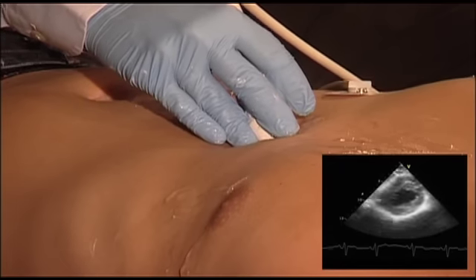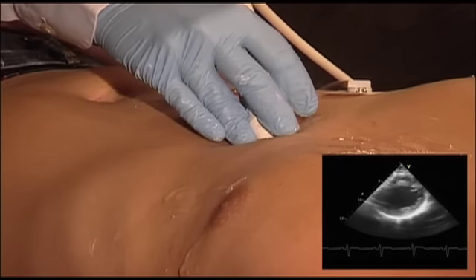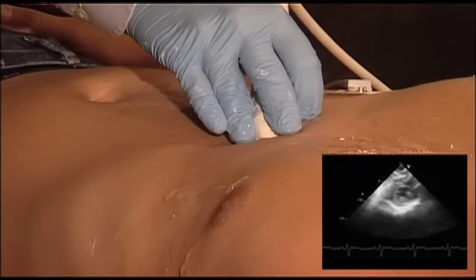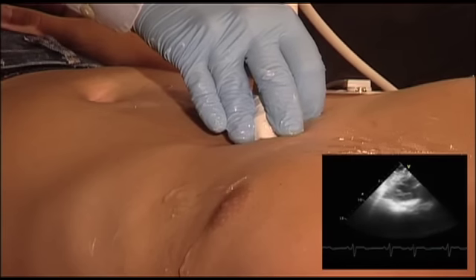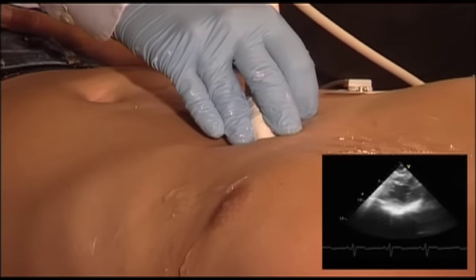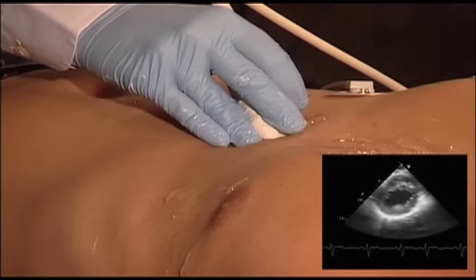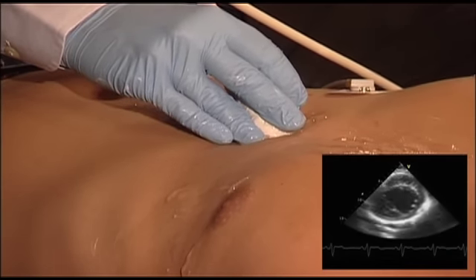By tilting the transducer towards the left, you will get more of the apical portions of the left ventricle. If you move it towards the right, you will get more of the basal segments of the left ventricle.